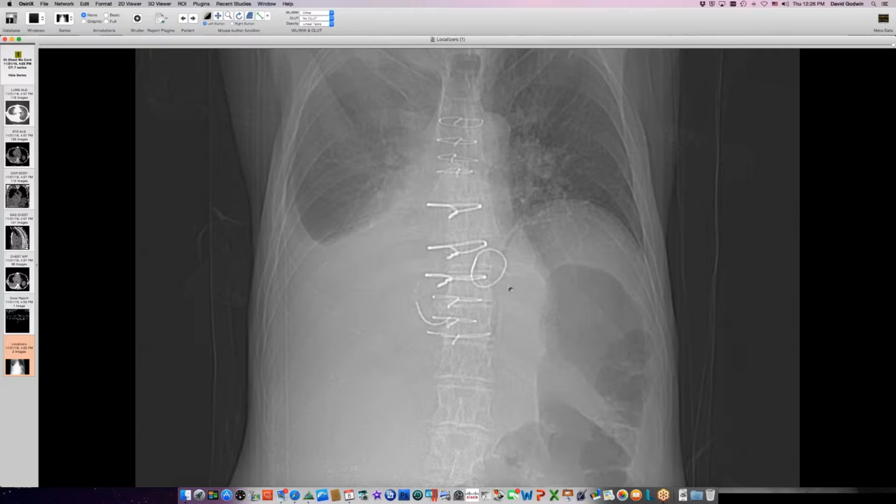I don't have any chest radiographs to show you, just the scout view here, but he does indeed have an elevated left hemidiaphragm. He's got pleural effusion on the right. He had mitral valve replacement and tricuspid annuloplasty. This thing looks kind of expanded. I wonder if it's really doing the job that an annuloplasty should.